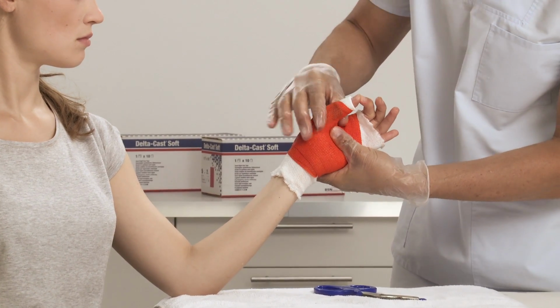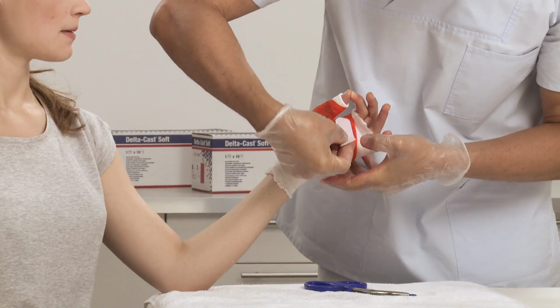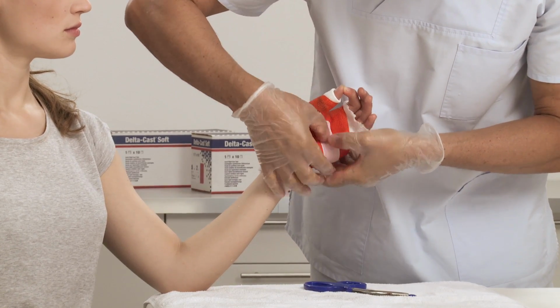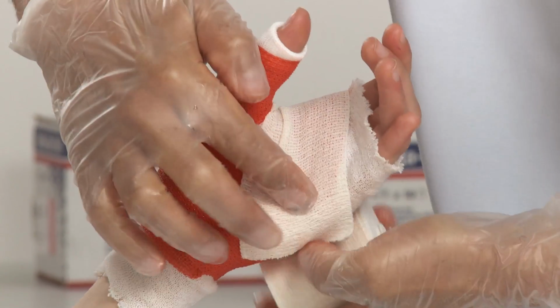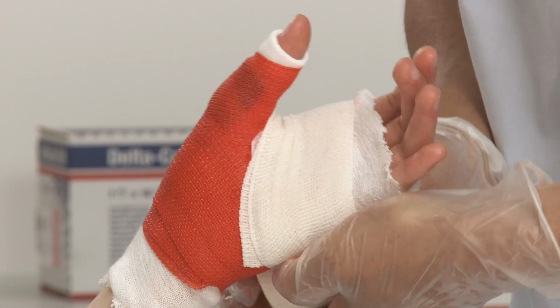Ask the patient to gently put the tips of thumb and index finger together, then mold and smooth the cast down. Cut a piece of adhesive hook strap and place it onto the cast tape. For good lamination of adhesive hook to cast tape, wrap elastic bandage around the cast using slight tension.